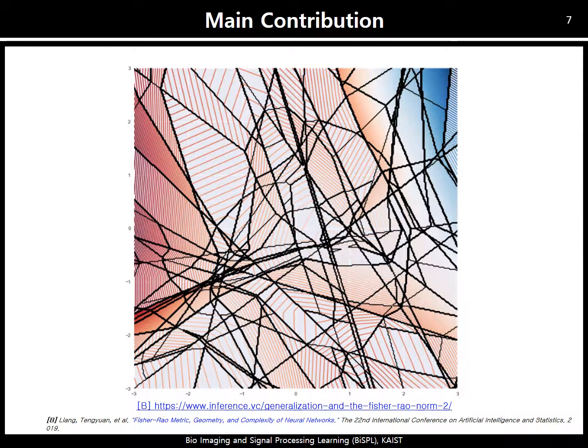In this regard, a convolution neural network with a ReLU nonlinearity provides an ingenious way of addressing this issue. Especially in a recent theoretical work, we have shown that an encoder-decoder neural network, a convolution neural network with ReLU nonlinearities, generates a large number of locally linear mappings. More specifically, the input space is partitioned into non-overlapping regions where inputs for each region share a common linear representation. Then switching to the corresponding linear representation for each input can be done instantaneously based on ReLU activation patterns.